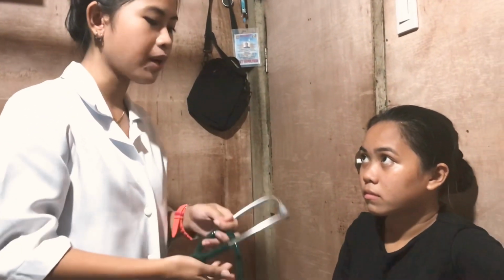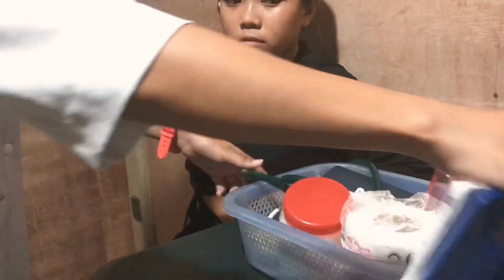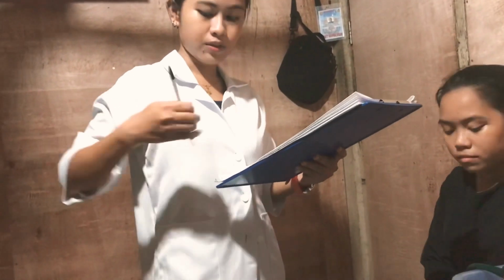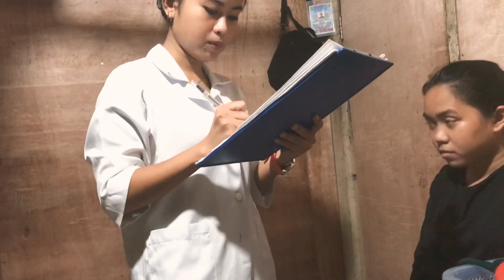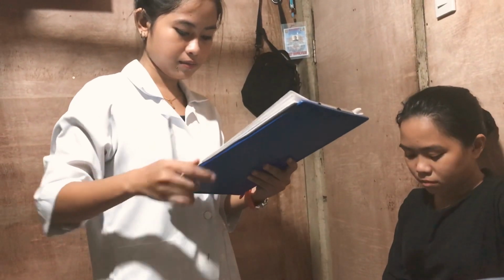Pulse, ma'am, is 85 beats. Now we'll record your apical pulse. And now, ma'am, we are done with your body temperature and apical pulse, and now we are on your third and fourth vital signs, which are radial pulse and respiratory rate.